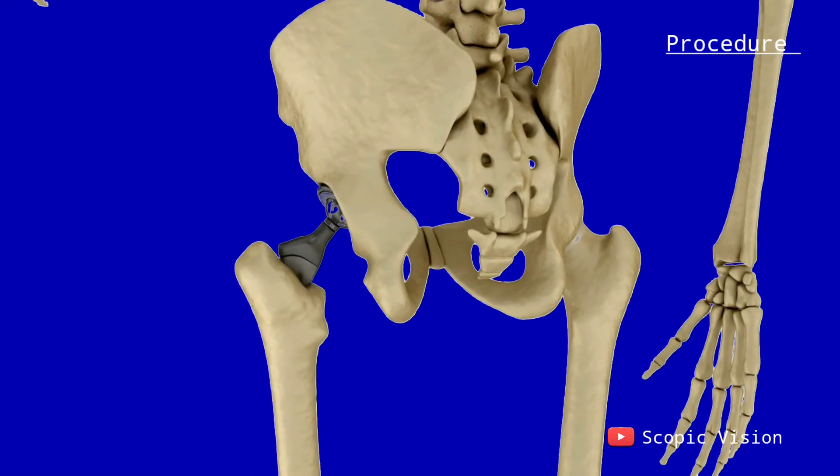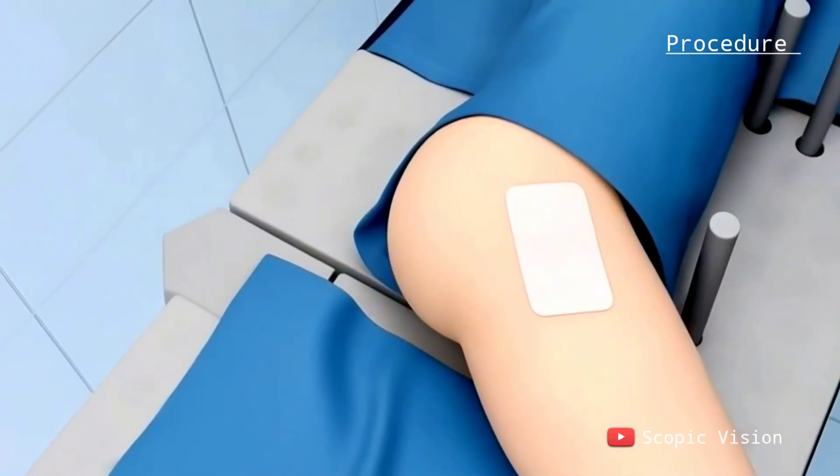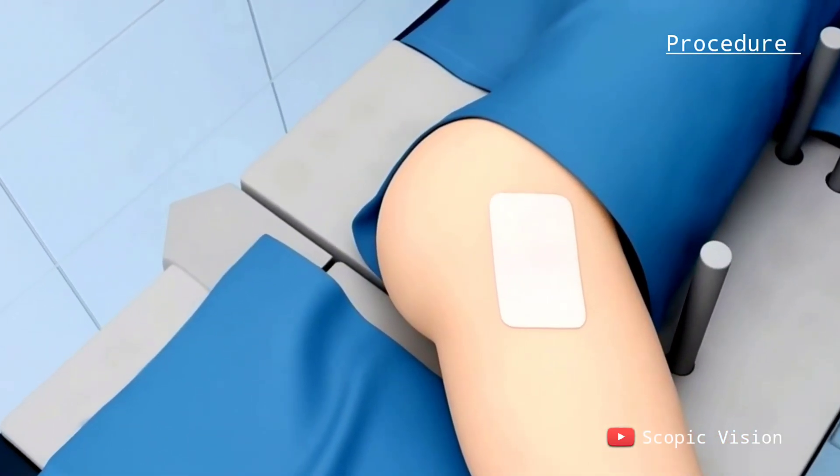Once everything is in place, the surgeon checks how the new joint moves and feels. After that, they repair the soft tissue and close the cut.